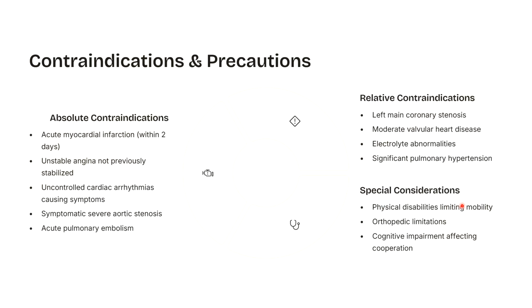Now, some special considerations are also there: physical disabilities limiting mobility, orthopedic limitations, and cognitive impairment affecting cooperation. So, apart from all these contraindications, there may be some special considerations relative to the physically challenged.